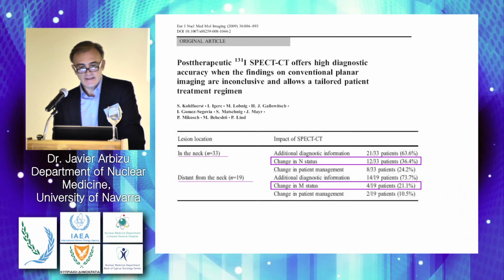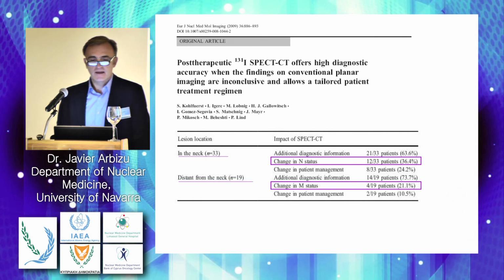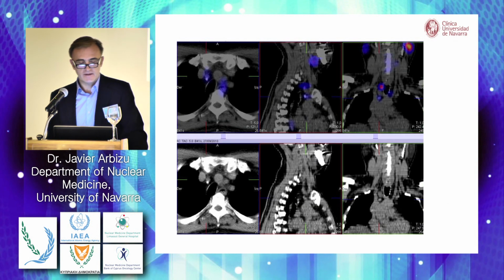And this is another one. Look at the change in the N status, approximately 36% in the neck, and distant from the neck, the change in the distant metastasis is 21%. So there is a clear clinical impact in the literature.